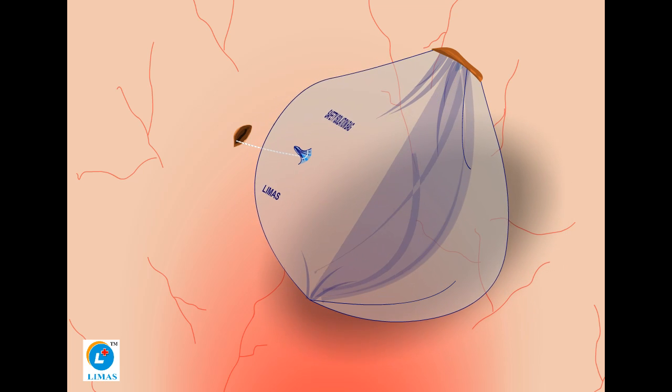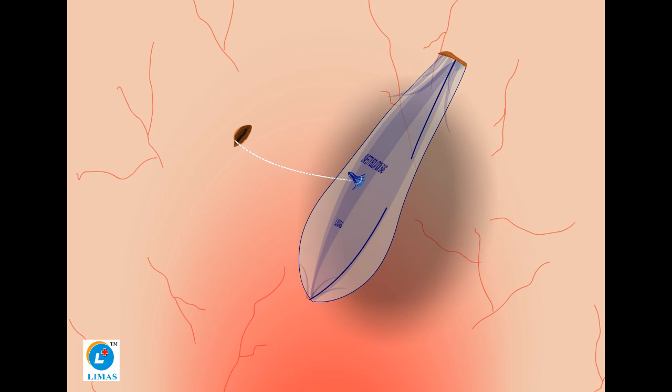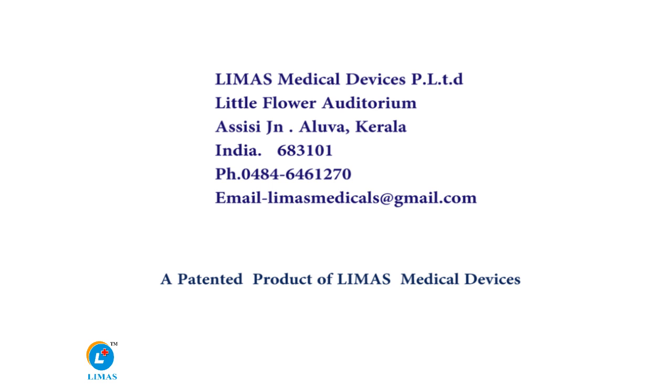Deflate the device and pull the looped thread tightly to close the puncture hole. Then pull out the Safety Isolation Bag through the morcellation port.